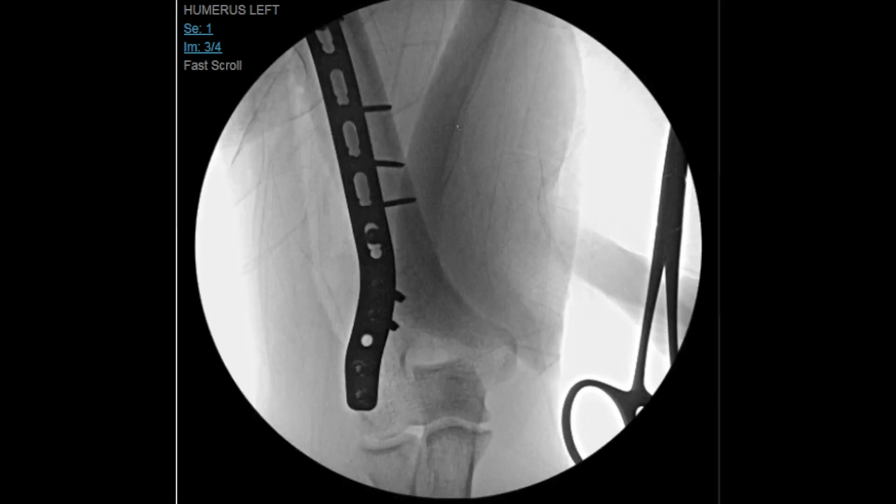After the lag screw technique, we placed a neutralization plate to hold the fracture in a stable position. We used a Synthes extra-articular distal humerus plate.